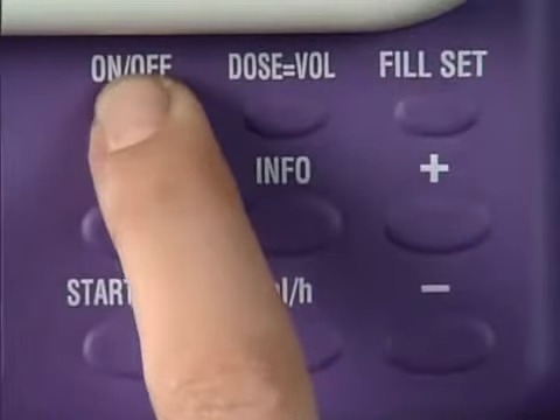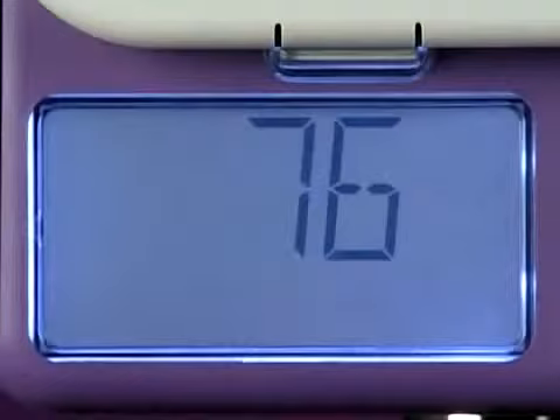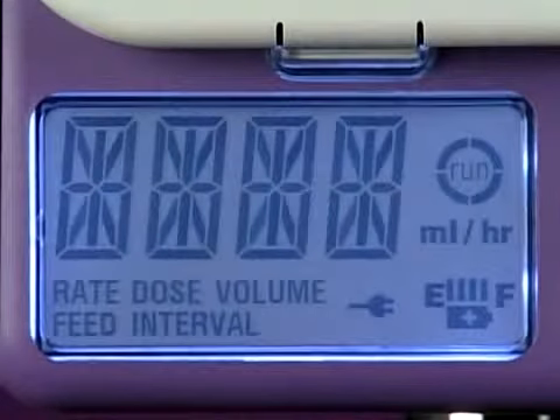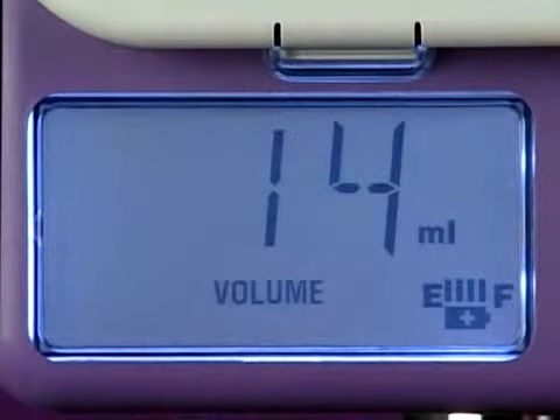Switch the pump on by pressing and holding the on-off key for two seconds until you hear a beep. The pump carries out a short self-test during which the serial number appears in the display. The series of numbers ends with the total volume delivered since the pump was last cleared.